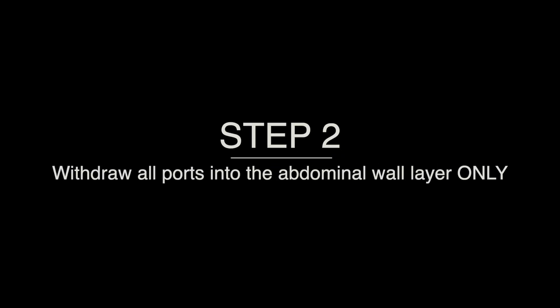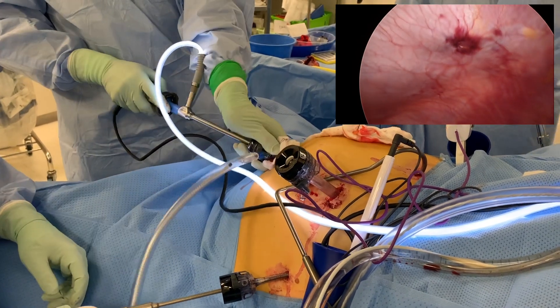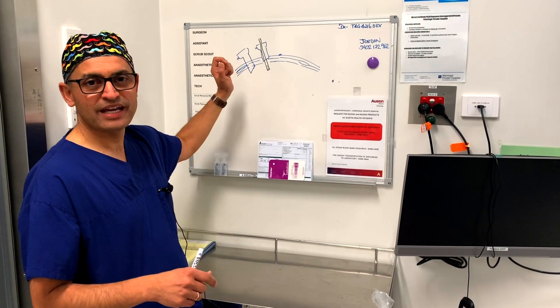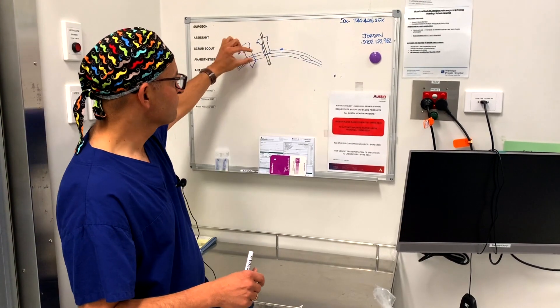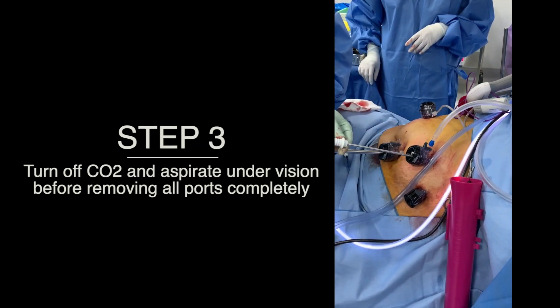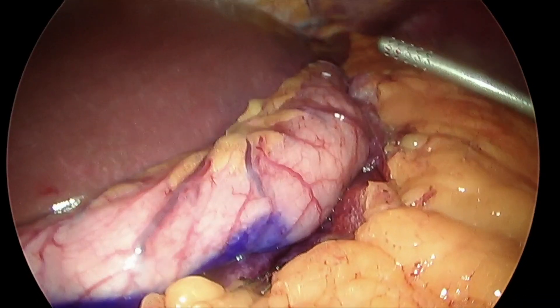The second step is that we pull all the ports out just into the sheath, into the skin — not all the way out. They are still within the abdominal wall thickness but not completely out. The third step is that we use the suction cannula to actually aspirate all the gas after turning off the carbon dioxide supply.